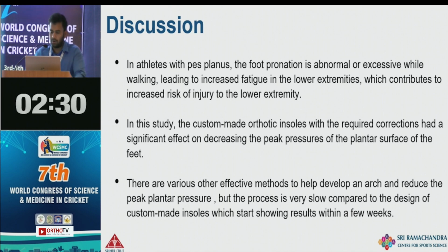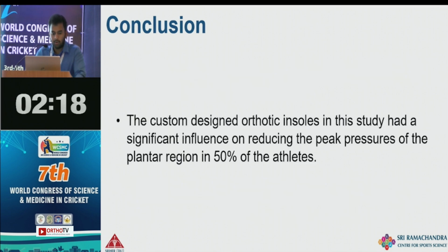Using the insole could help reduce the peak plantar pressure compared to exercises, which might take a longer time to show the results. In conclusion, the custom designed orthotic insoles in the study had significant influence on reducing the peak pressures of plantar region in 50% of the athletes.